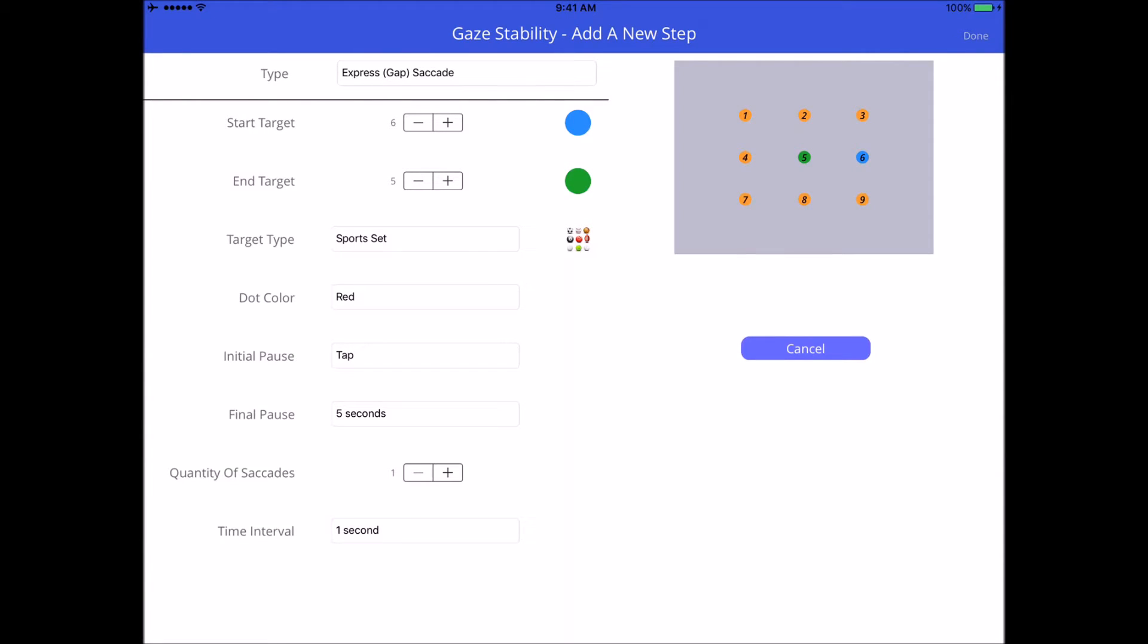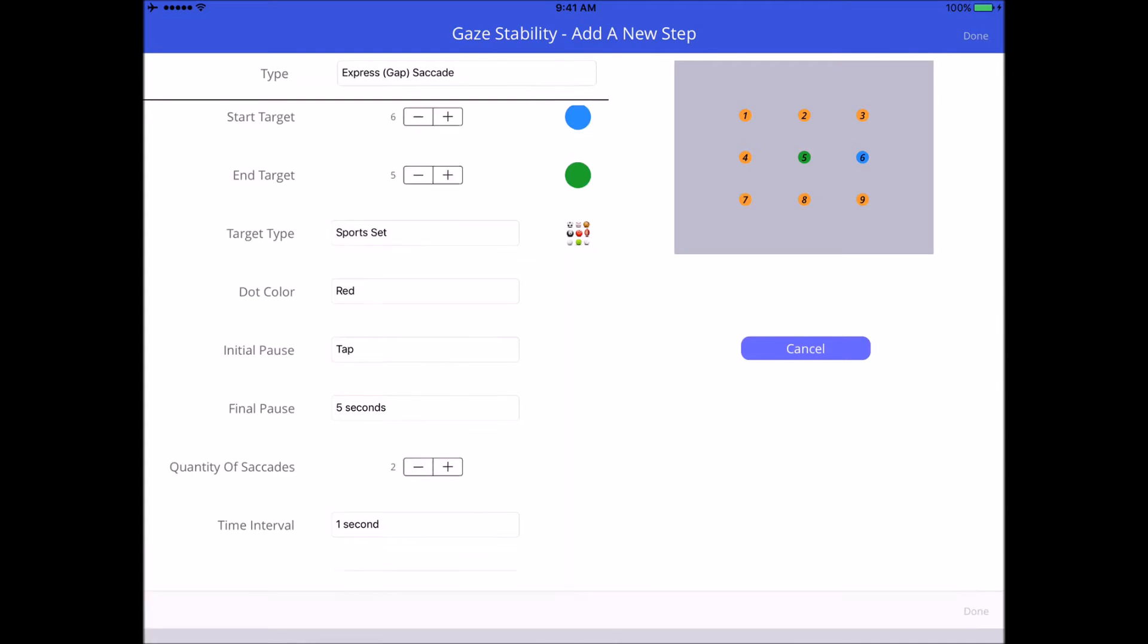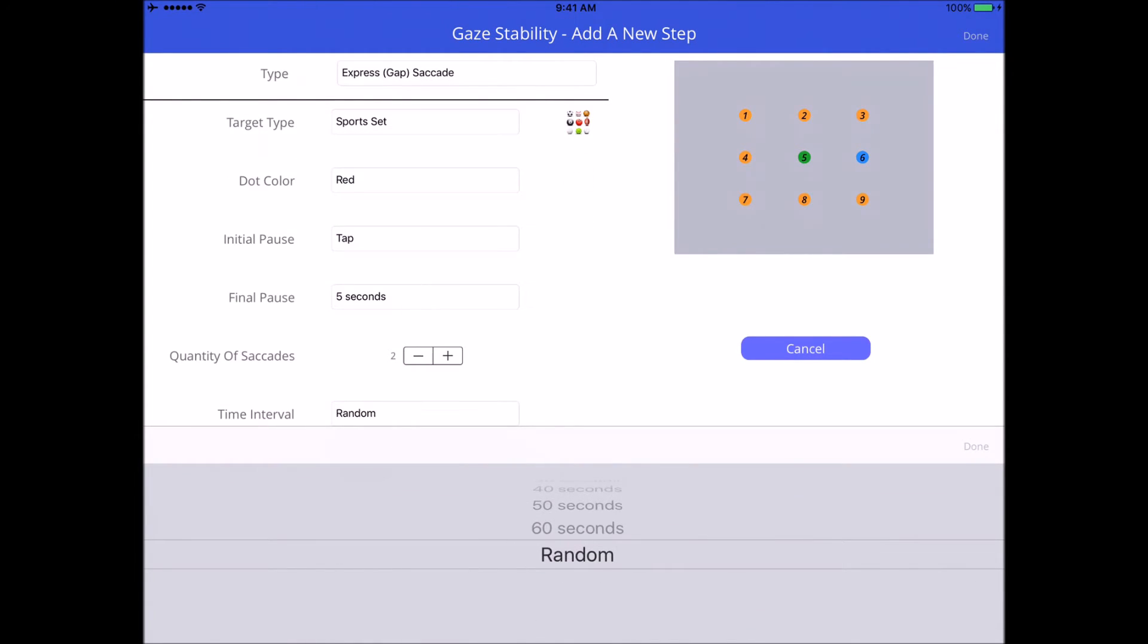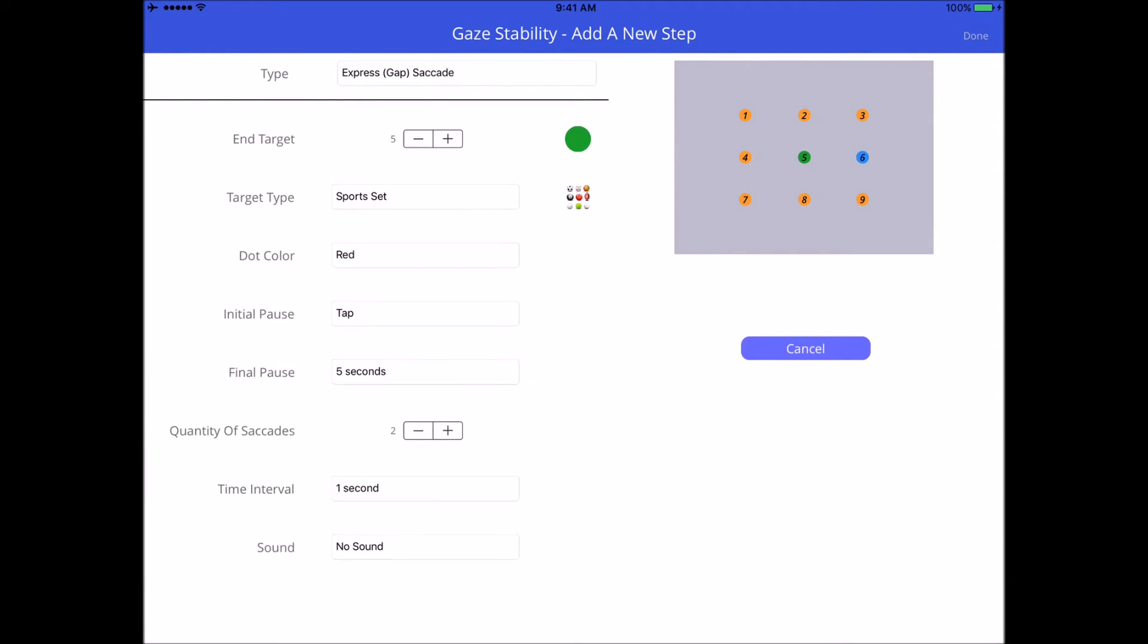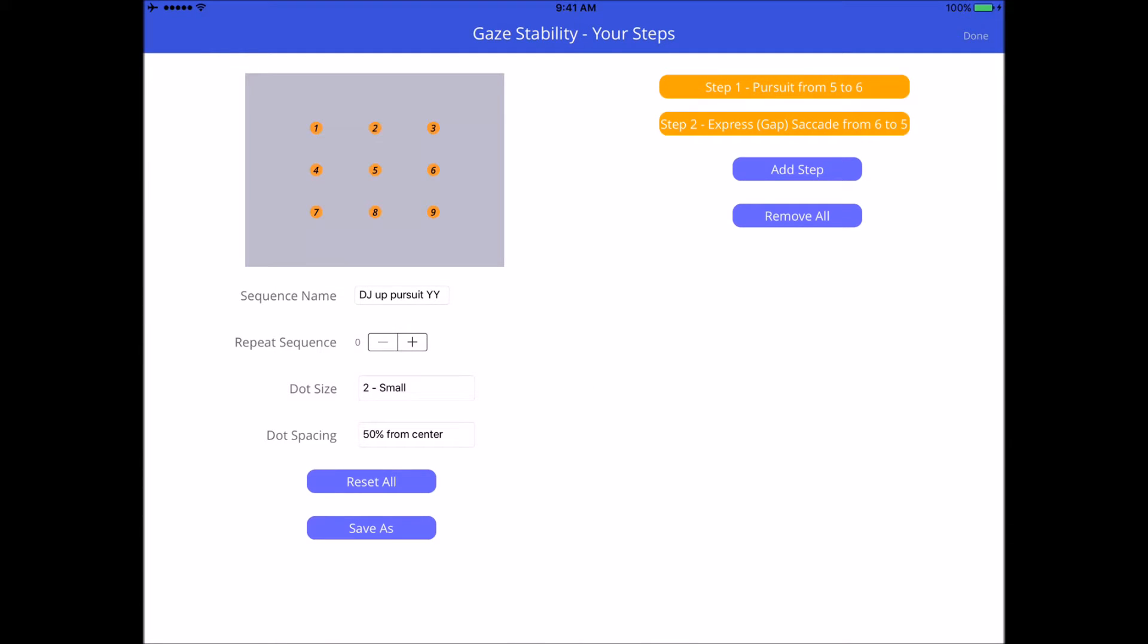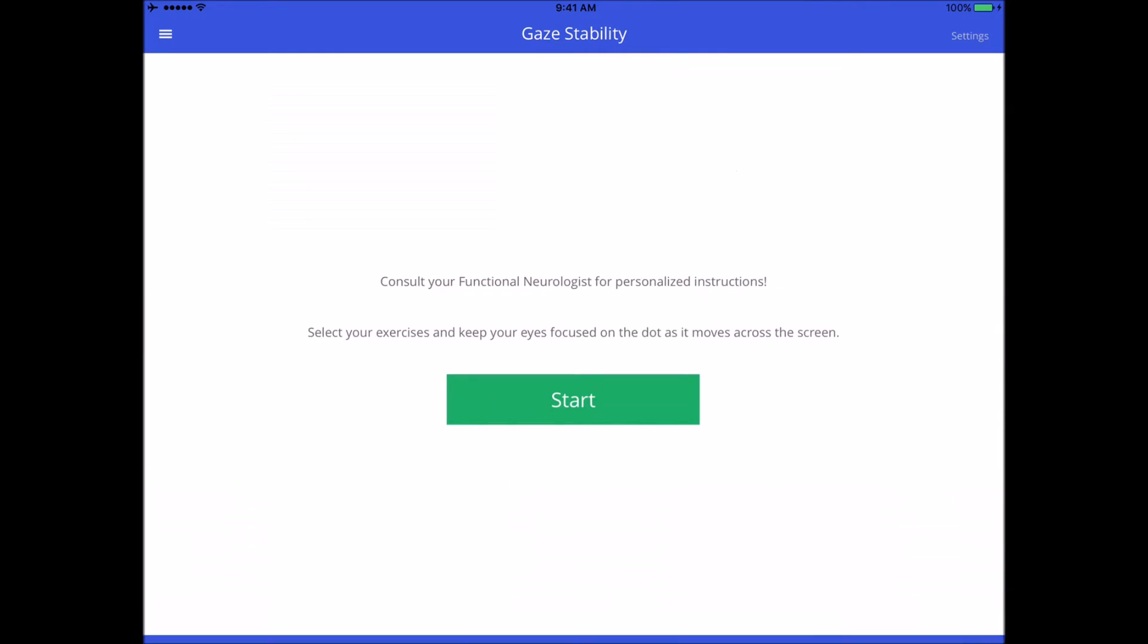Initial pause time I'll make it a tap, and final pause let's make it five seconds. Quantity of saccades, I can decide how many micro saccades I want to go from number six to number five. It could be one or it could be five. Let's just make it two. Time interval one second. Any of that can be changed all the way down to random. We'll keep it at one for now and save.